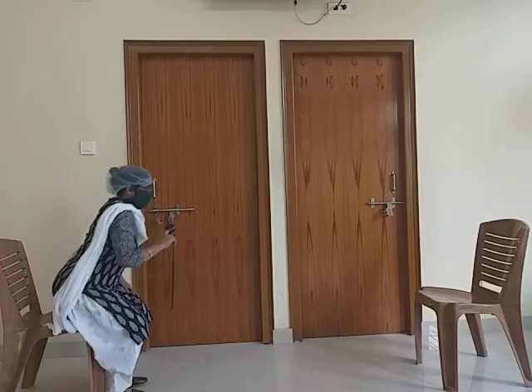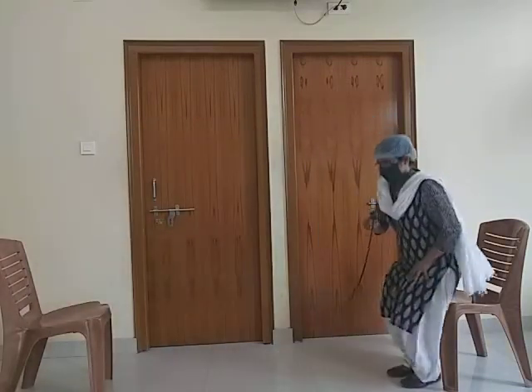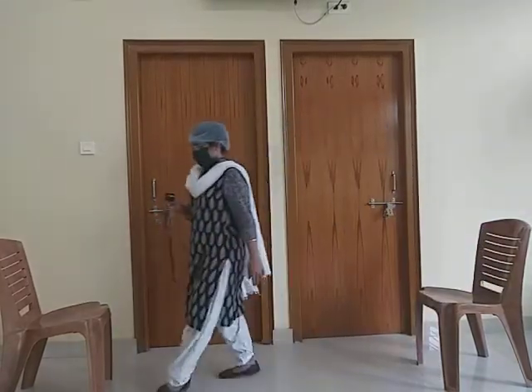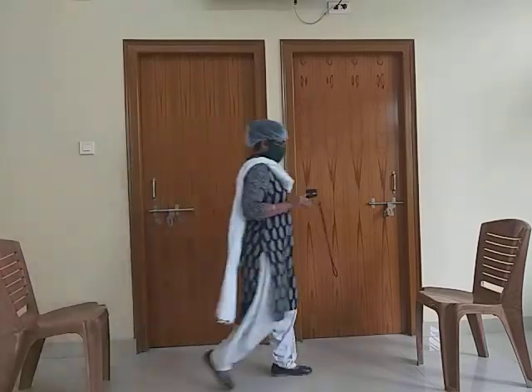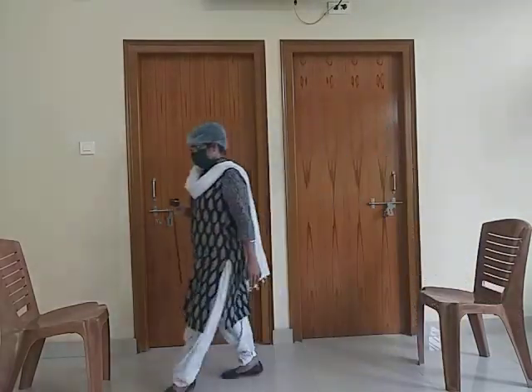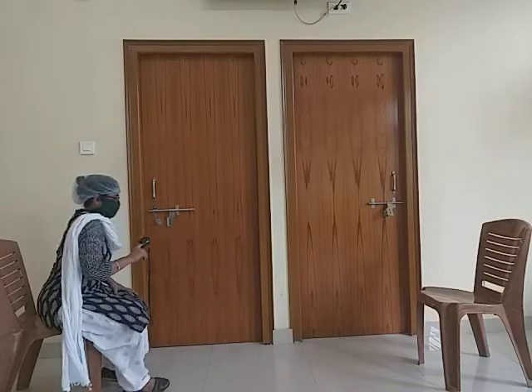This is the two-chair test. We'll be noting the post-exercise saturation and pulse rate immediately after the exercise, and thereafter at every 10 seconds for two minutes. We are going to see the post-exercise recovery response.